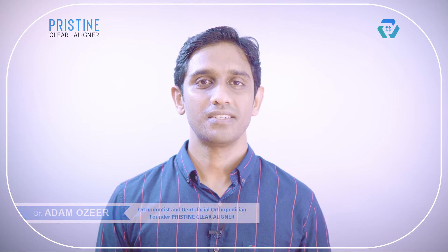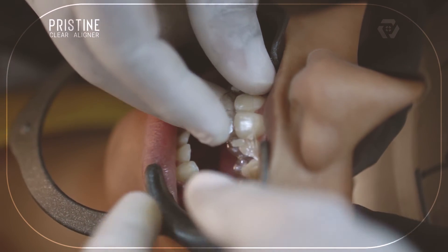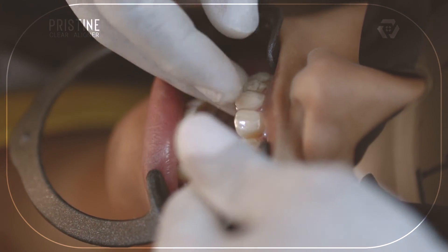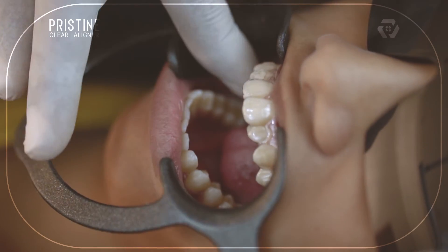After loading the template, place it onto the teeth and check for adaptation, especially in the posterior region. The hard sheet will have better adaptation than the soft sheet. While placing the soft sheet template, you should be very careful — you need finger support before curing it.